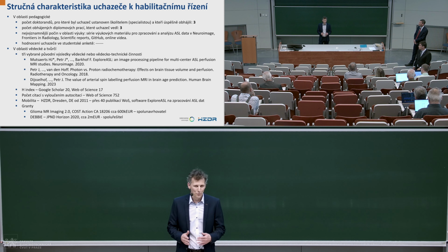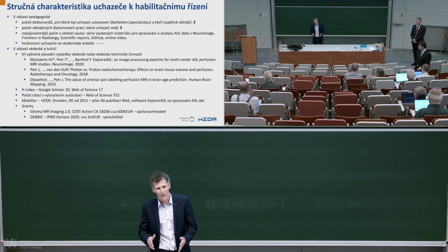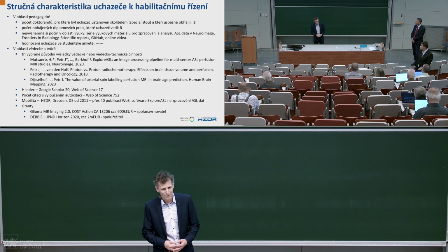And then, of course, there's the trade-off between a nicely working method that is easily calibrated but has different deformations and doesn't perfectly fit the image, and the one that fits the image perfectly, but you need to focus on the exact relaxation times of the specific tissue and so on. I don't have the perfect answer because it needs to be studied more to draw a definite conclusion. I think it works pretty nicely. Most of the challenges could be overcome by measuring the T1 time of the tissue and so on.